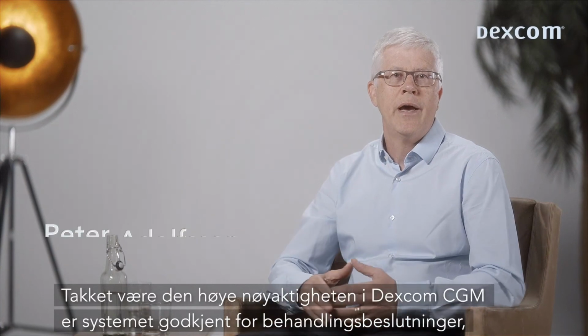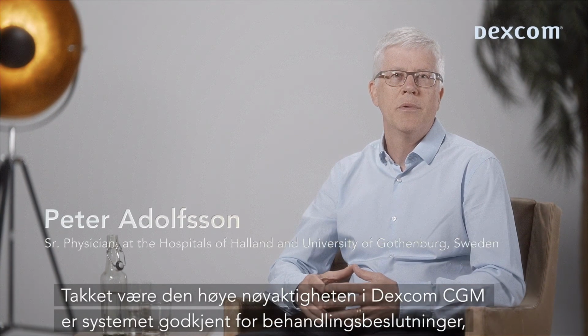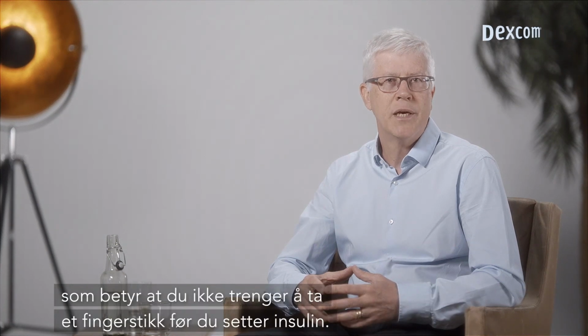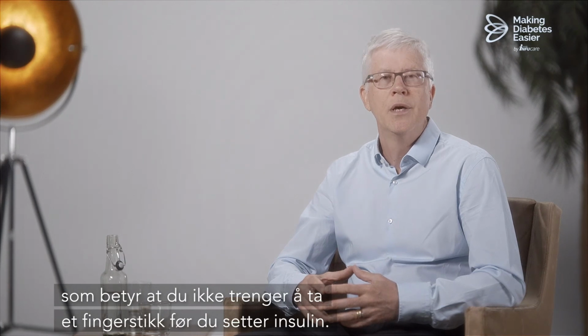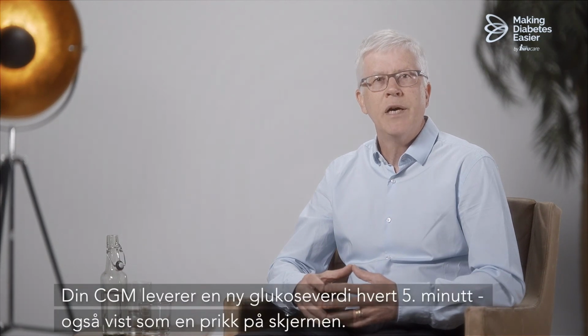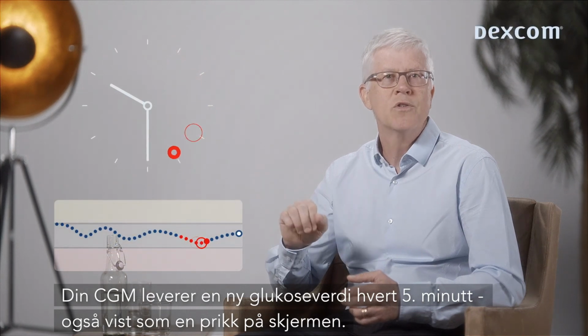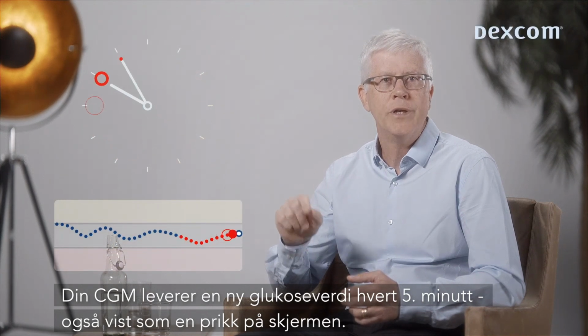Thanks to high accuracy in Dexcom CGM, the system is approved for treatment decisions, which means that you don't need extra finger sticks before you take insulin. Your CGM provides a new glucose value every 5 minutes, also shown as a dot on the screen.